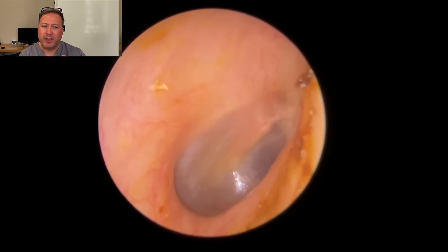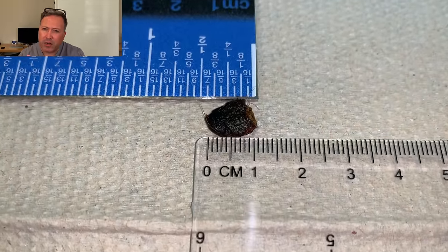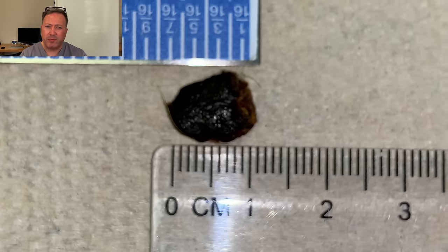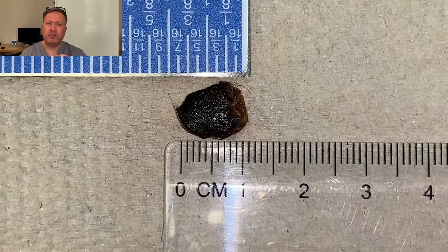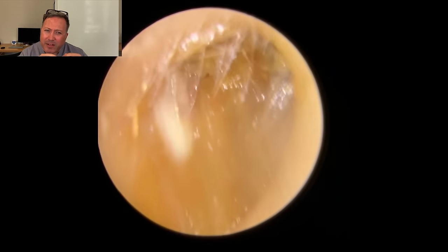There's the eardrum there, looking nice and healthy. Good light reflex, you can see there. Very, very dark coloured wax, this one. So very old, been in there quite a long time. So we've got a centimetre, was that just under half an inch, I think, is it? Yep, just under half an inch there. So yeah, you can see little hairs embedded in there as well.